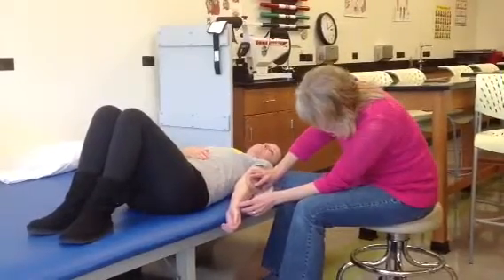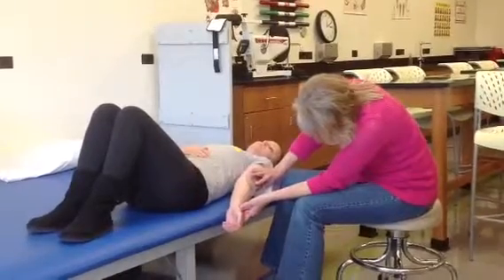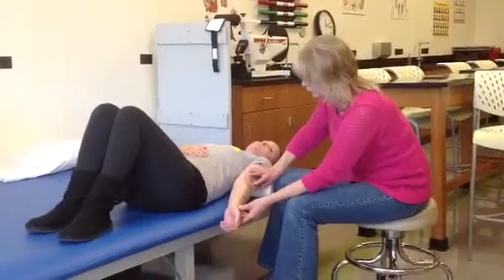And so we're going to just have her relax her hand and do a measurement, and it doesn't look like she really has any hyperextension. She's right at 0 for her extension.